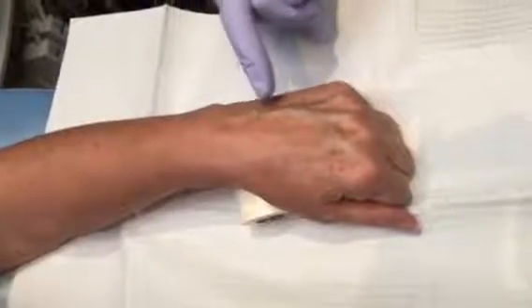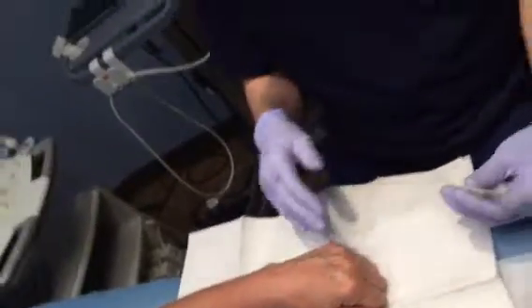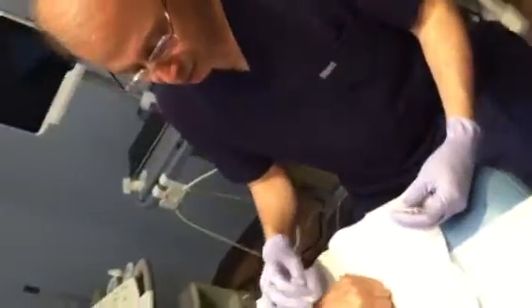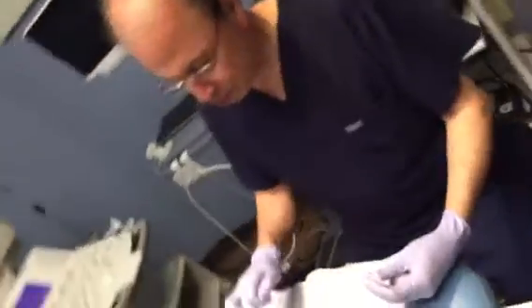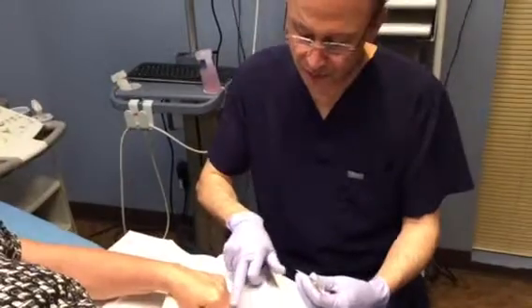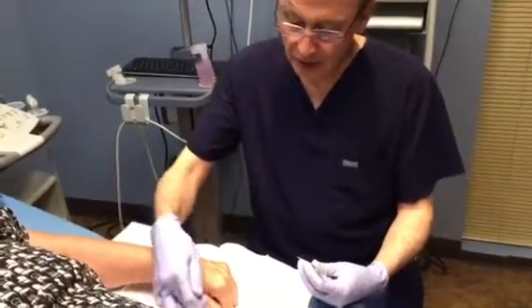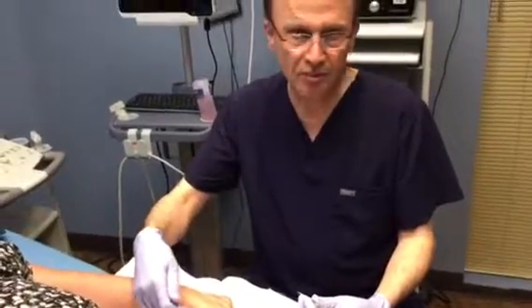I'm going to show today how to do foam sclerotherapy of the bulging veins in the back of the hands — the dorsal veins. The treatment should be really limited to just the dorsal area and not extended to other veins, not extended to the finger veins. If there are veins here, I would not inject those, and also not thumb veins.